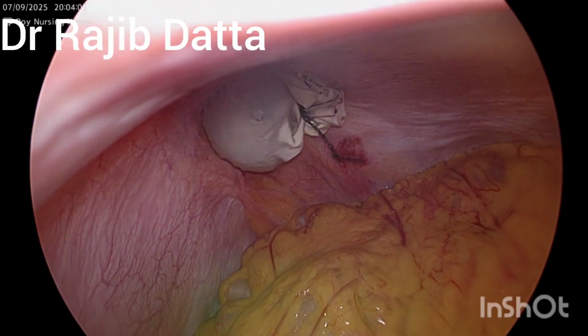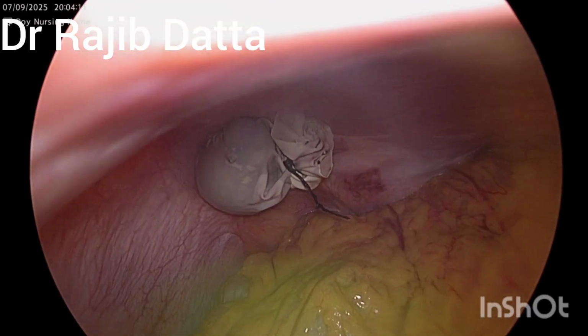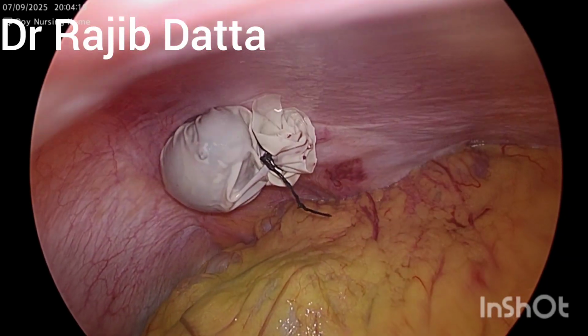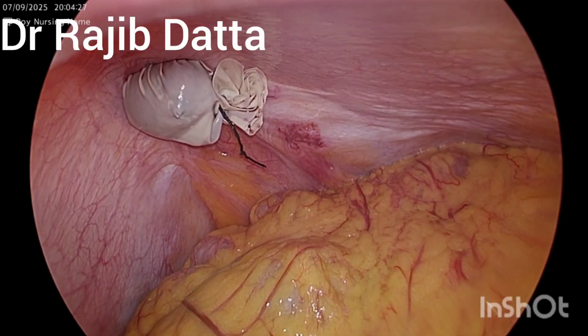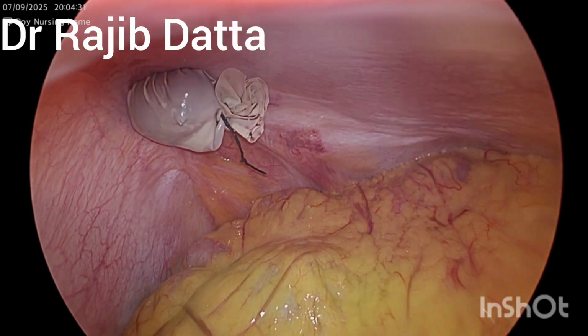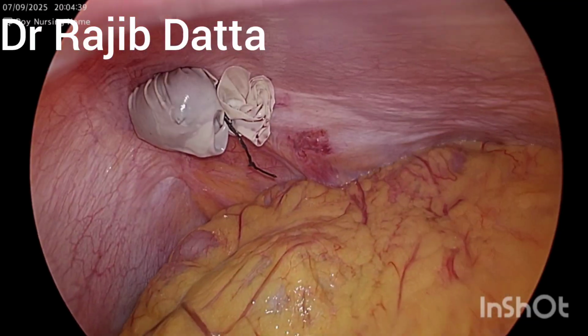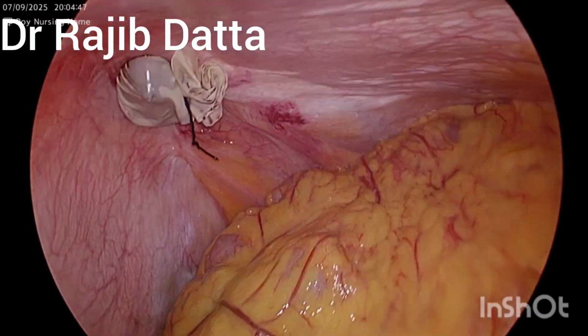So we will check the pelvis after retrieving the gallbladder out from the umbilical port, so that the cause of the pain can be well appreciated after proper laparoscopic visualization.